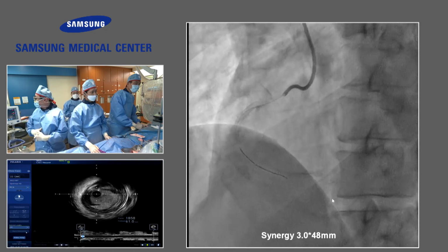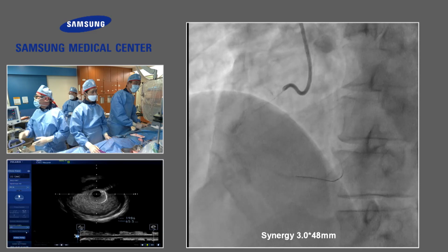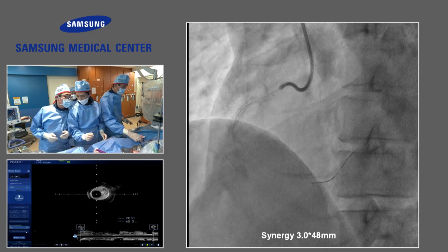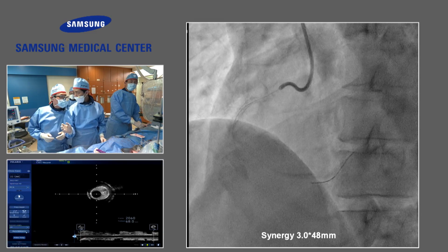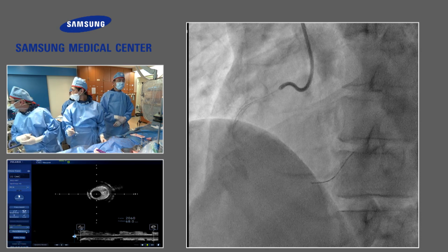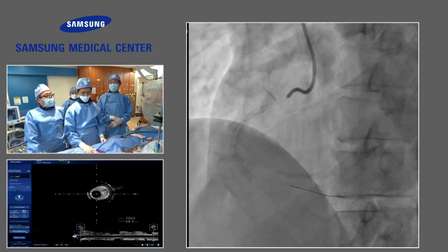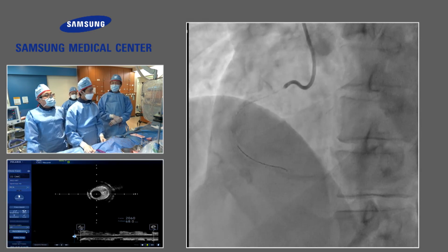Recently, the size of the stent doesn't matter much to me. If you insert a 3.0 or 3.5, the risk of restenosis is very small. At least the data show that the stent thrombosis rate is higher with a small, long stent.